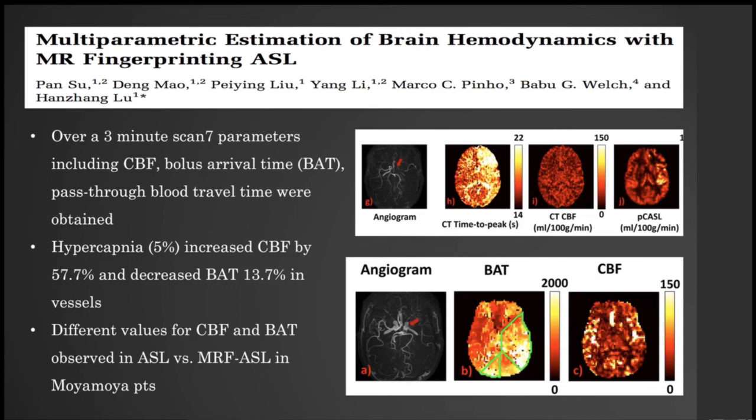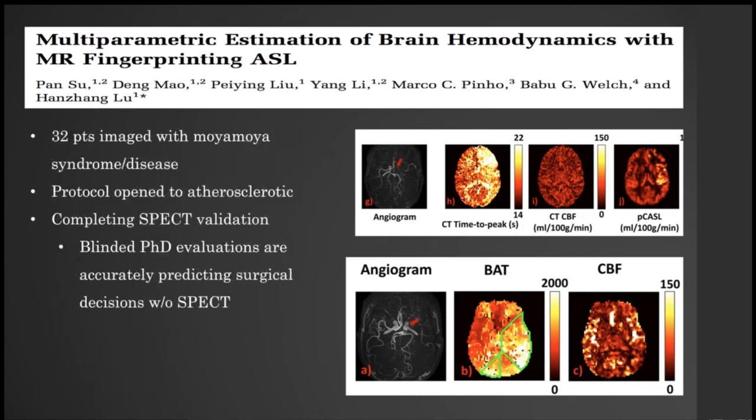So what we're doing now is looking at an hour and a half. We can get MR, MRA, vessel wall imaging, and pre and post inhalational studies, and that's pretty decent that the patients can get through. We've had one patient that got dizzy, but as I've told many of you, she was kind of dizzy before, so there really hasn't been any side effects from that.